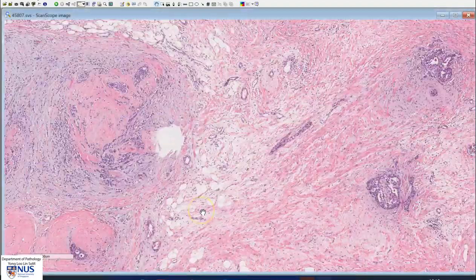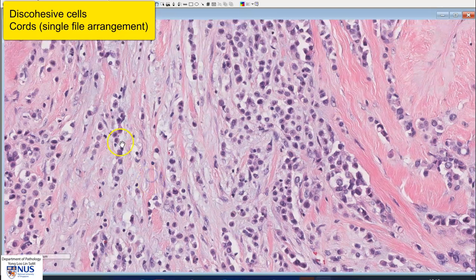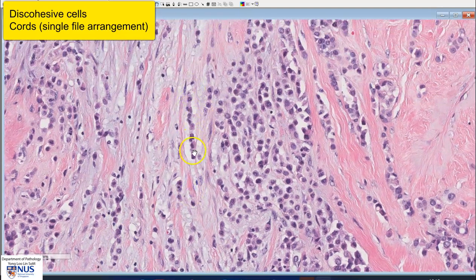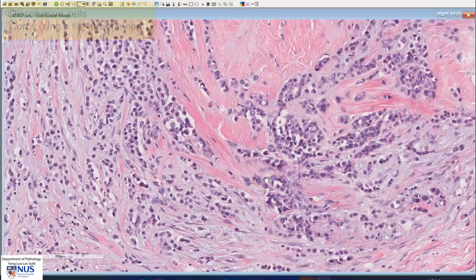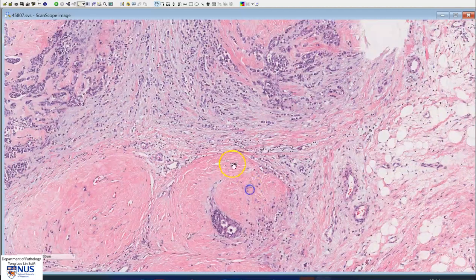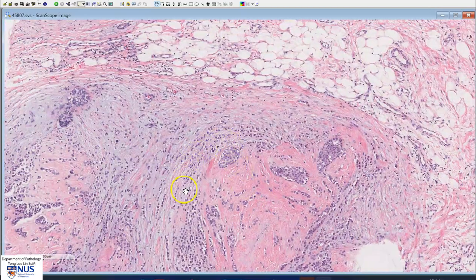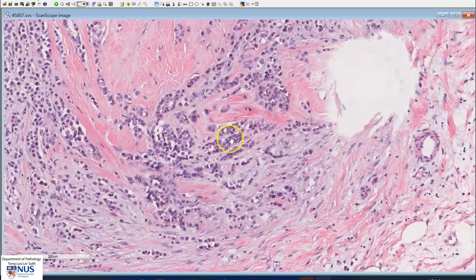Moving on to the invasive tumor, we see infiltrates of discohesive single cells. Sometimes they occur in cords, and they have been described as having a single file arrangement. Sometimes they also occur in concentric formations around benign ducts or areas of LCIS. In this particular case, you can sort of imagine that they form these concentric rows around native structures. Some of the cells are also arranged in trabeculae, which are slightly broader cords of two or three cells thick.